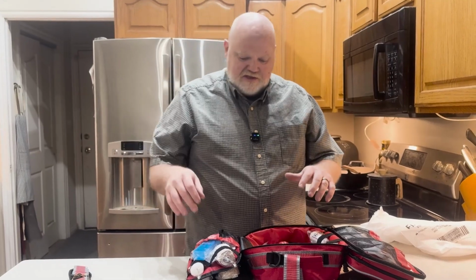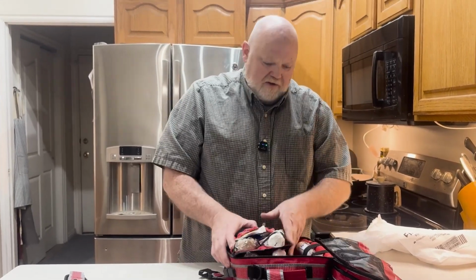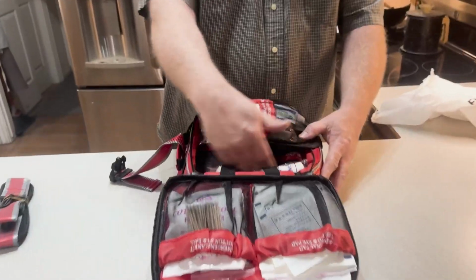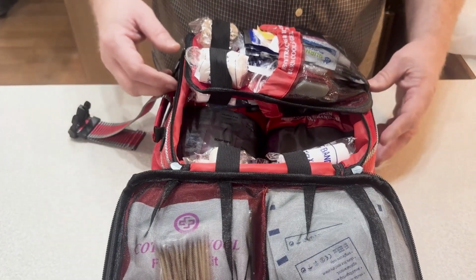So between the tweezers, the scissors, there's a few more instruments I would add if you are trained in them, like stethoscope, blood pressure cuff, and you have room in this. I mean, you got some room there to add your blood pressure cuff and your stethoscope. If you want to do that, you don't necessarily need to.